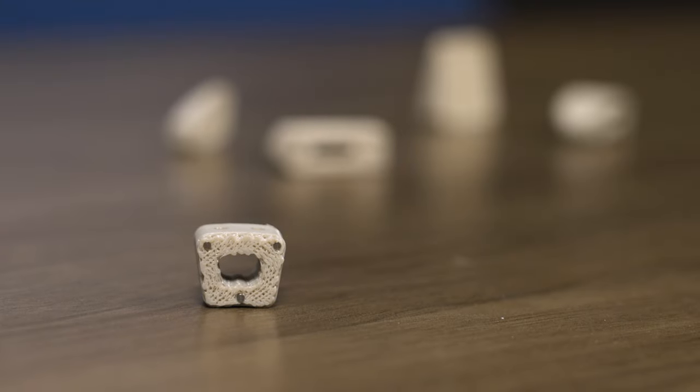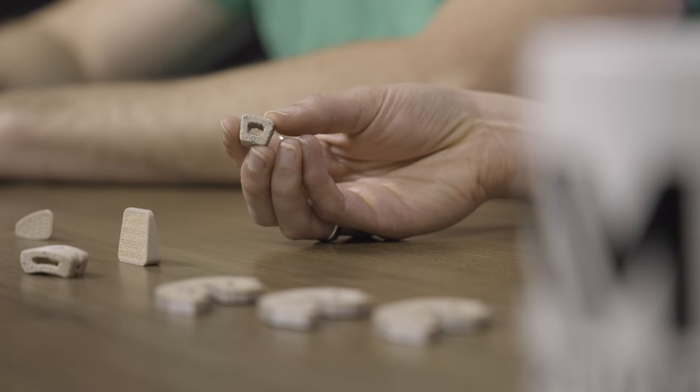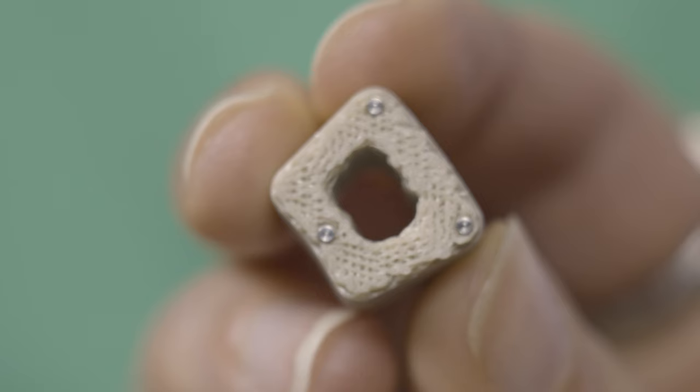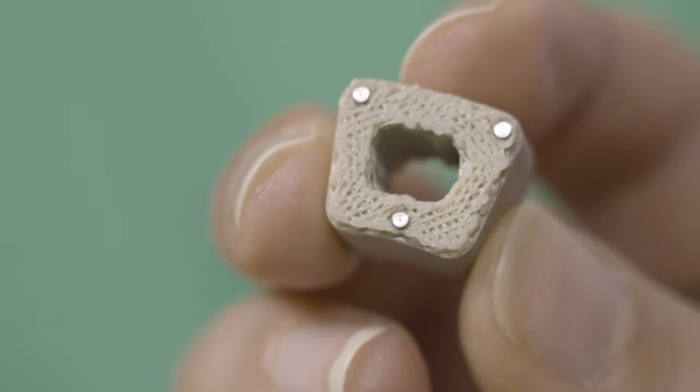We want you to test this without your metal markers in there. They might be strengthening it. Or we want you to do testing above and beyond what those standards call for. Now, of course, we were a little concerned about doing so, but we did. And in fact, our mechanical properties didn't change, which demonstrates to us that our Z-layer bonding and our control of our internal structures is really quite robust. And the mechanical strength and the process qualification demonstrated a very, very tight process.